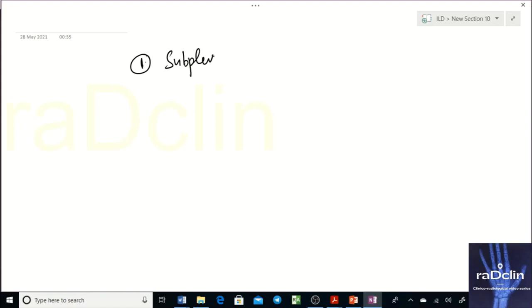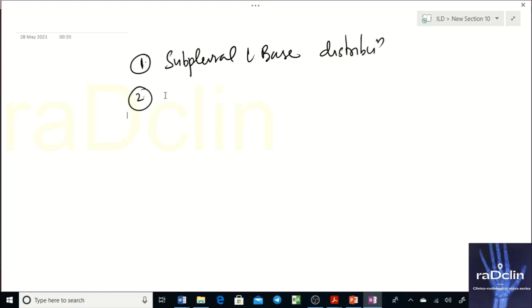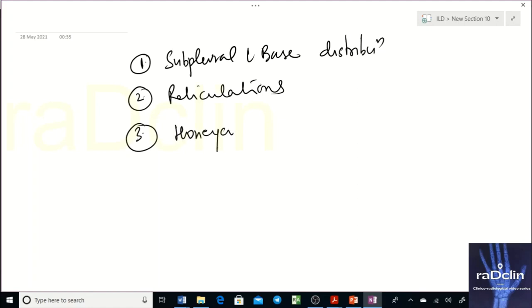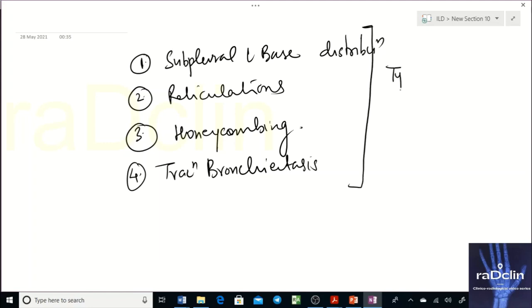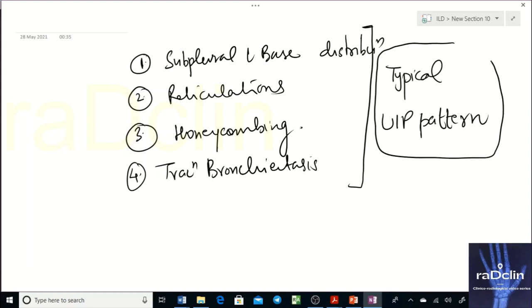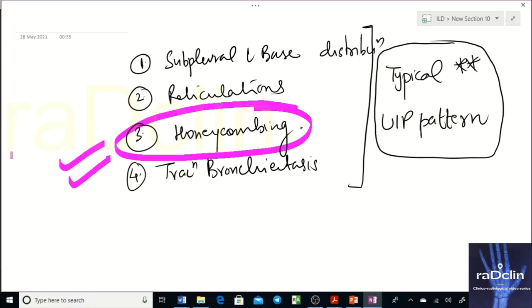The four key findings of the typical UIP pattern are: first, subpleural and basal distribution; second, reticulations; third, honeycombing; and fourth, traction bronchiectasis. If I had to pick the single most important finding to call it a typical UIP pattern, it would be honeycombing.